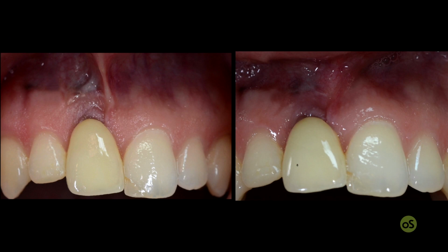In the picture on your left, you can see the situation that the dentist sent to me before his treatment.